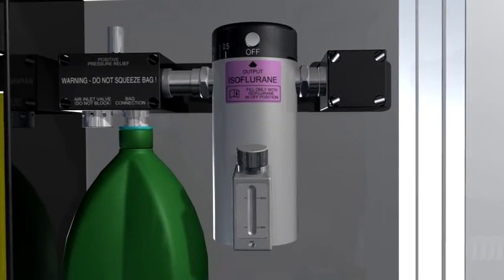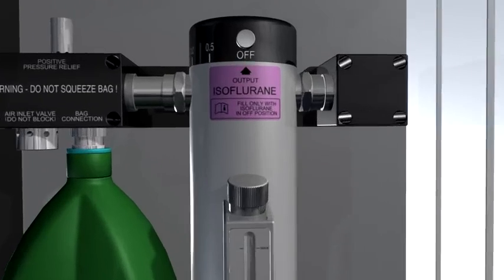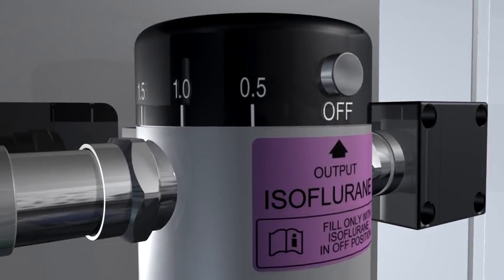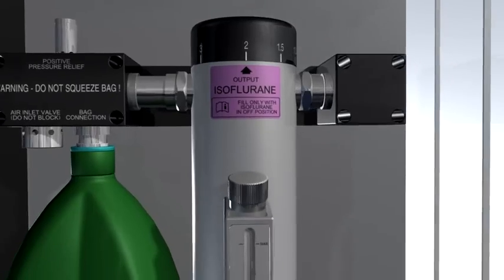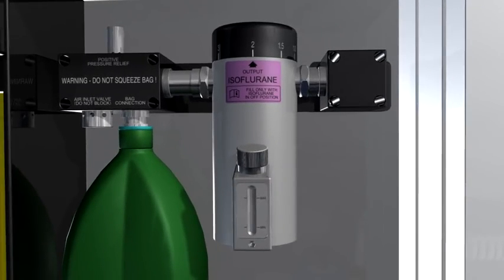The low resistance draw over vaporizer adds volatile agent to the carrier gas passing through it. Volatile agent is added by using the selector wheel to achieve the desired percentage. We now have anesthetic gas comprising oxygen, volatile agent, and a variable amount of room air.